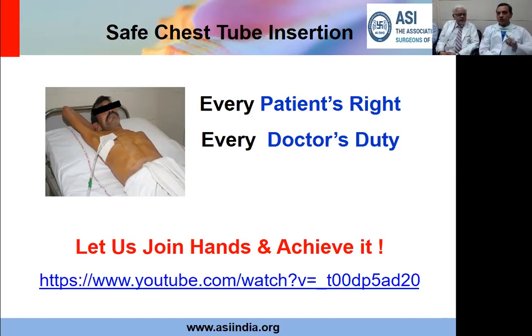How long can we keep that? Just one addition. Sure. So antibiotic is not for chest tube site infection. Antibiotics these people will be getting for concomitant associated other problems like chest infection, abdominal infection, bone injuries or other injuries. Those are more important.